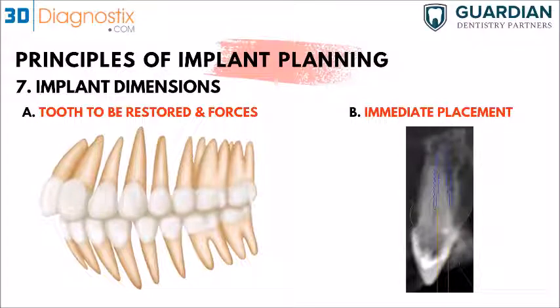What you want to look for here is to have the implant stable at the time of placement. This is an example of the same implant, but different length. Right here, this is the apex of the 10 millimeter implant. It doesn't look like it's going to engage that much native bone apical to the socket. So we move on to a longer implant, and that would help you engage more of that bone and end up having better stability for that implant. This is another factor where you have to choose to use a longer implant.